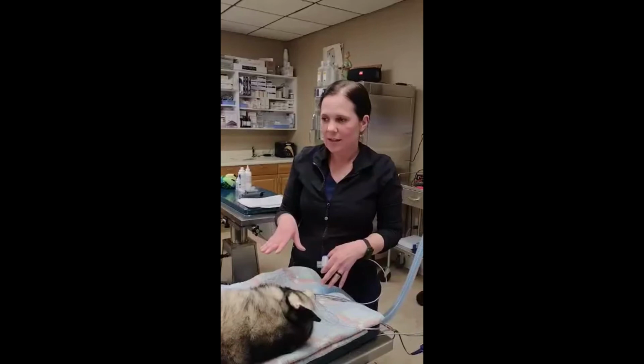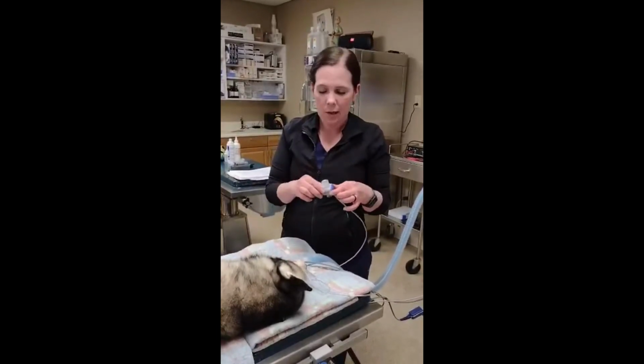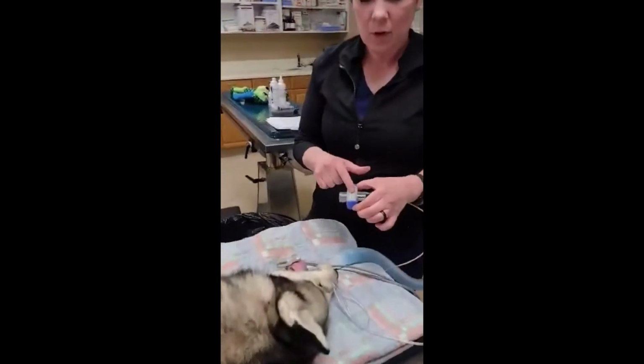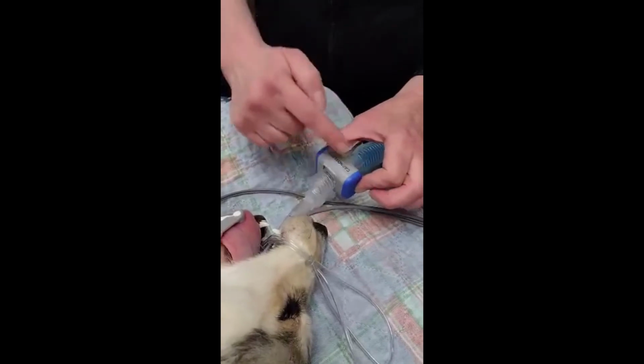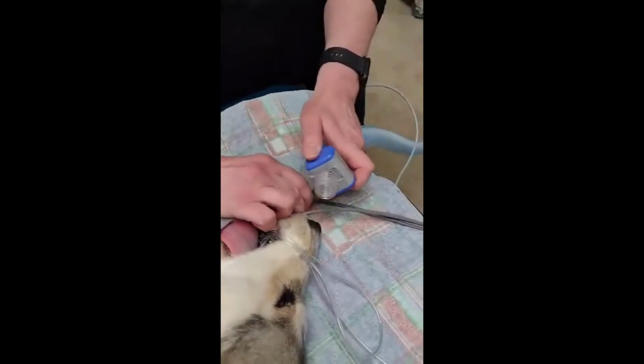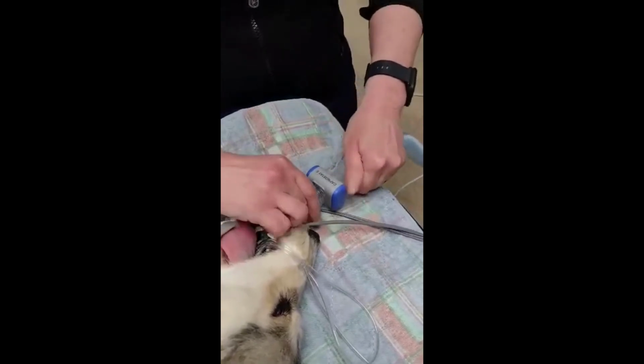I have a patient that is under anesthesia, or theoretically one that is undergoing CPR, and I have her intubated. I'm going to attach our capnometer. This is a mainstream capnometer, which means that it attaches between the endotracheal tube and the breathing circuit, and it's going to take that reading right here. All I'm going to do is briefly disconnect, attach here and here.